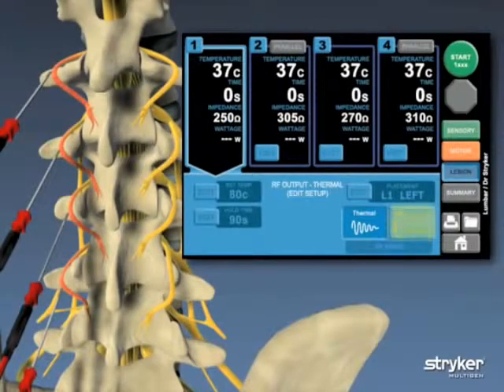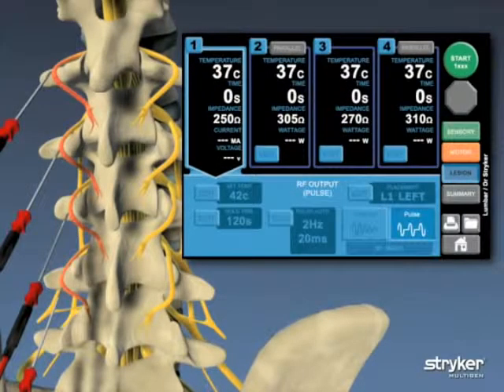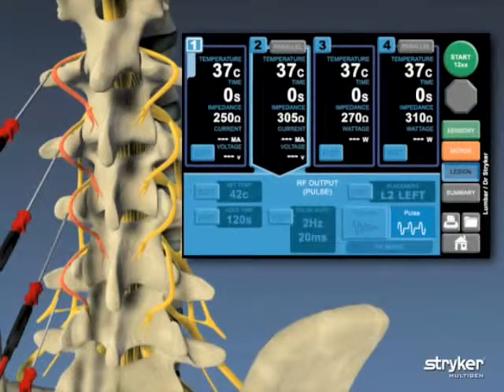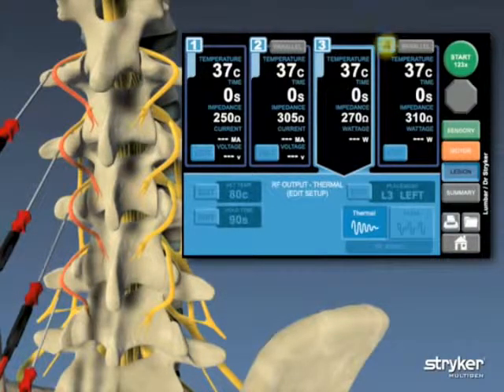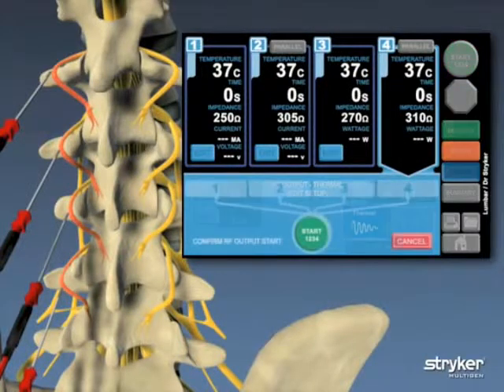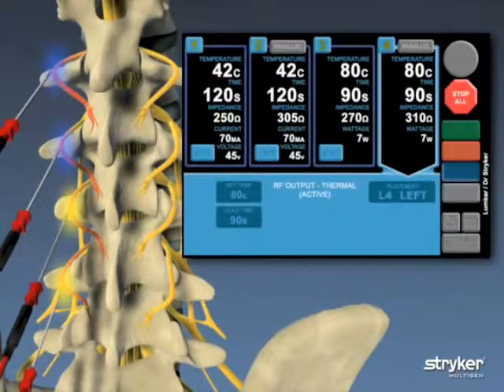The needle placements and therapy types are chosen, the locations are locked into place, and the user presses start. After confirming that they are ready to begin by pressing start a second time, the thermal and pulsed radio frequency procedures begin simultaneously at the specified location.